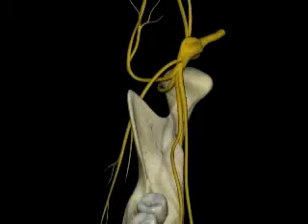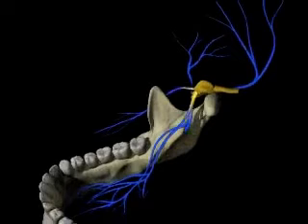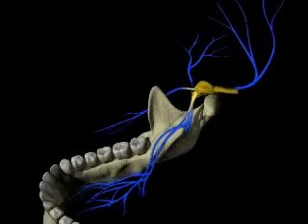The objective of the Gates technique is to deposit local anesthetic immediately anterior to the neck of the condyle. This is in close proximity to the mandibular branch of the trigeminal nerve after its exit from foramen ovale. With the Gates technique, we should be able to anesthetize all of the sensory branches of this nerve, including any accessory nerves.